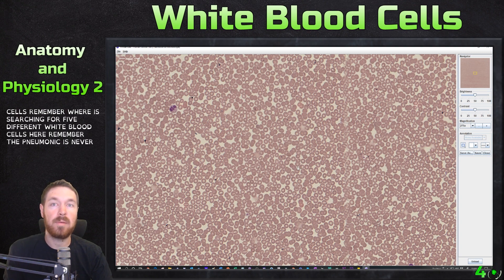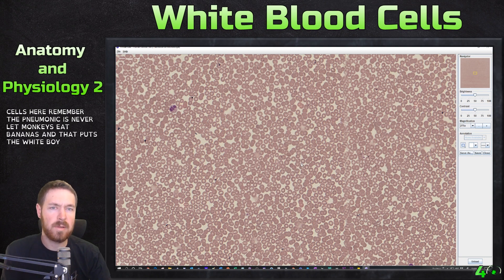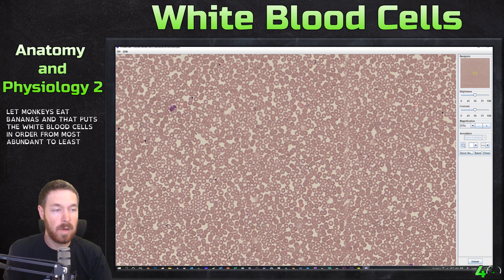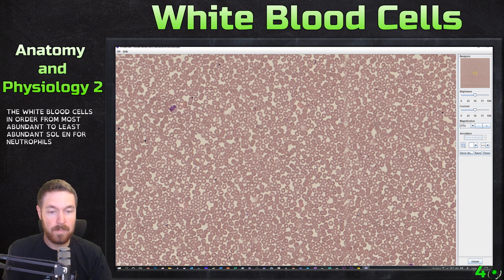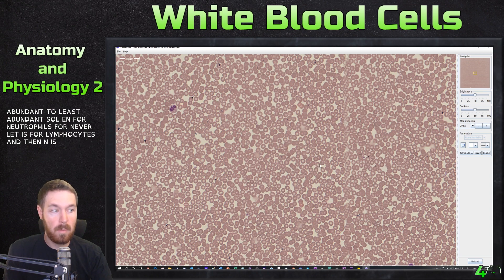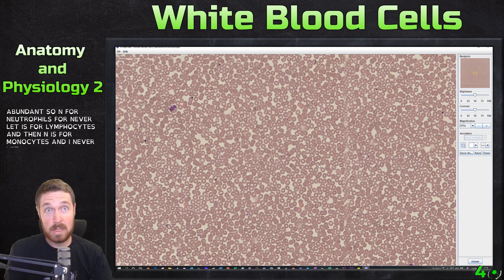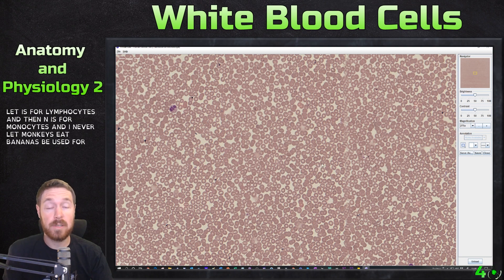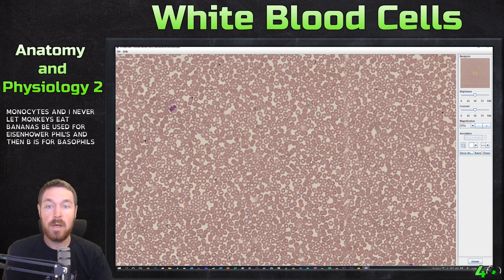The mnemonic is 'Never Let Monkeys Eat Bananas,' which puts the white blood cells in order from most to least abundant: N for neutrophils, L for lymphocytes, M for monocytes, E for eosinophils, and B for basophils. We're going to find all of those today.